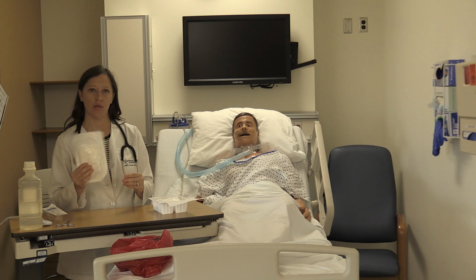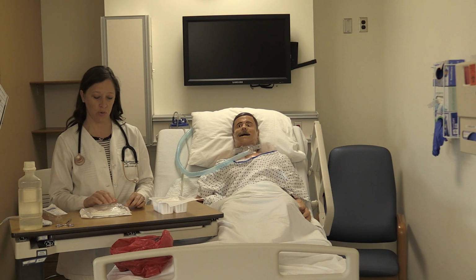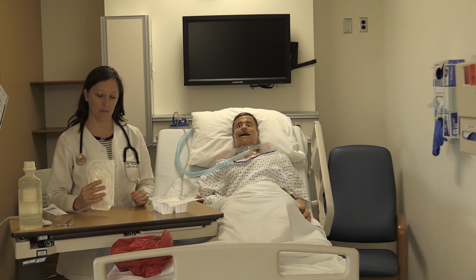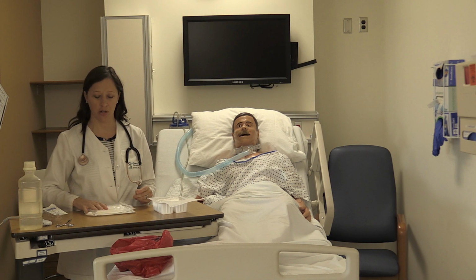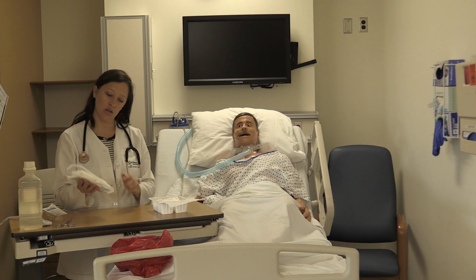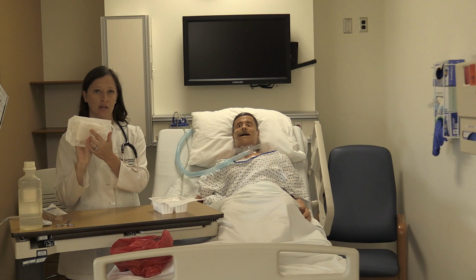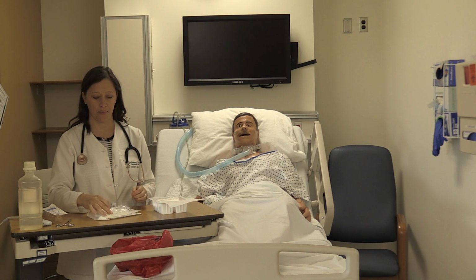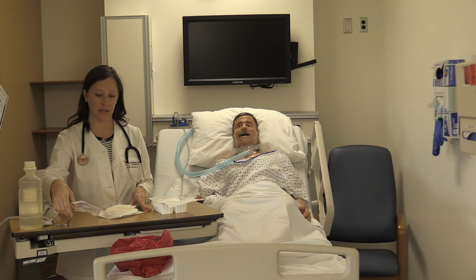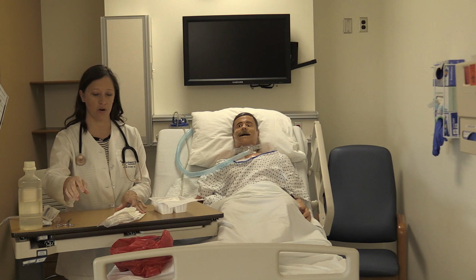When you open this kit, make sure that you open it on the right side so that you can get to your gloves. If you look at it and you see that the gloves are right underneath the sterile drape, then open it that way. So you're going to open that, making sure not to let everything fall back over it.